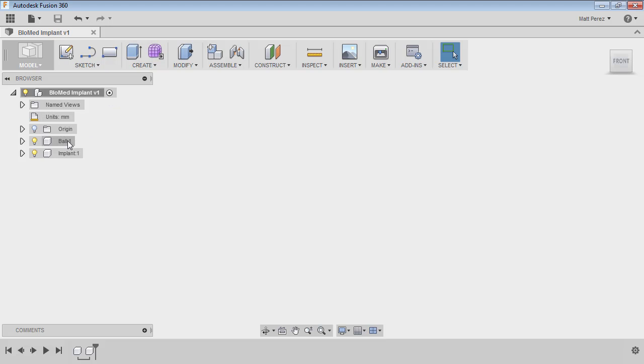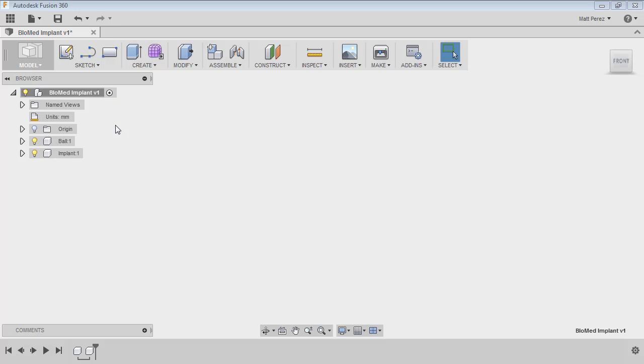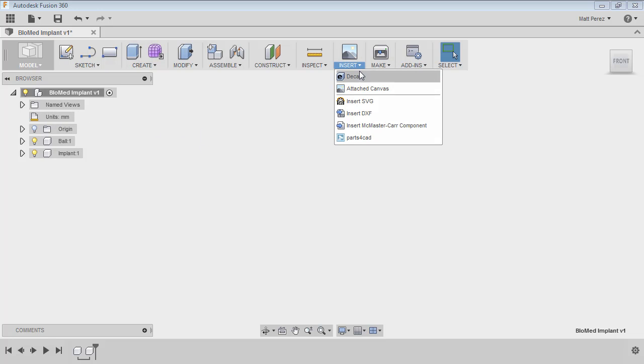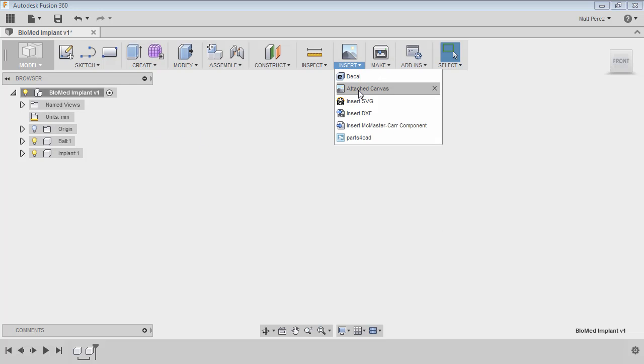You'll notice that the radio button to the right of it—we want to make sure that that's active and that one of these specific components is not active. The reason I want to do that is I want my canvas images to be located at the top level. I don't want them to be inside of the ball or inside of the implant. I want them to be located at the top level of my file. And also notice that our units are millimeters. Again, very important.